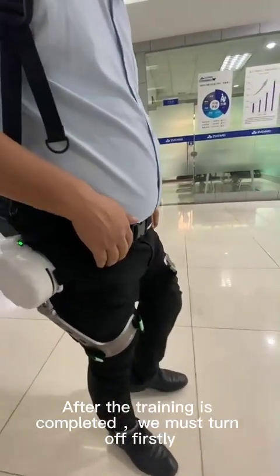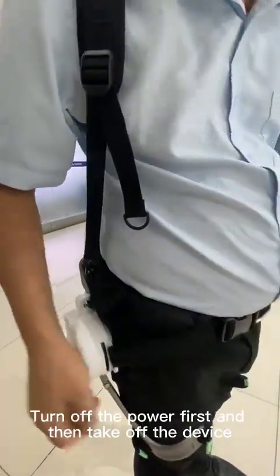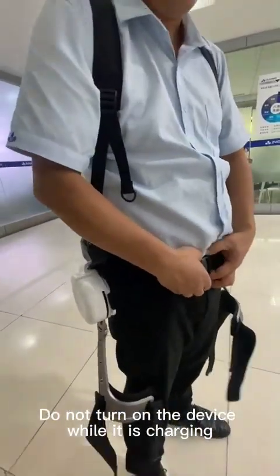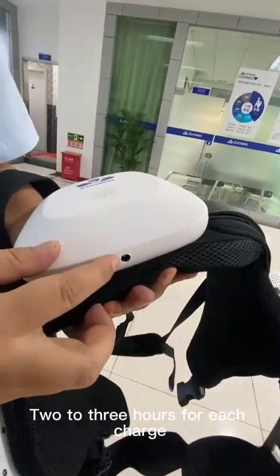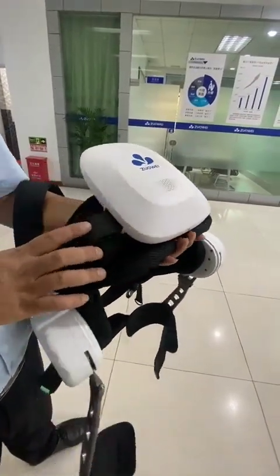After training is completed, turn off the power first, and then take off the device. Do not turn on the device while it is charging. The charging port is here — each charge takes two to three hours, and a full charge can be used for two and a half hours.